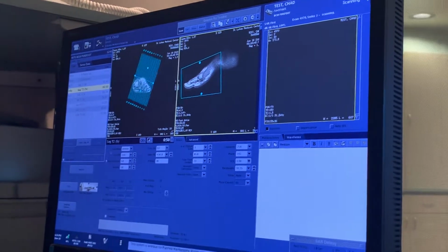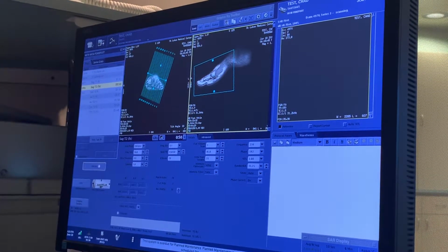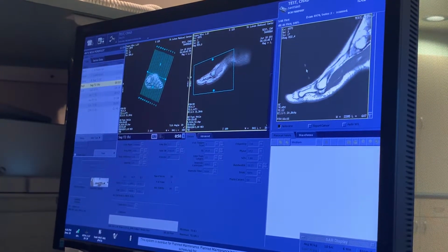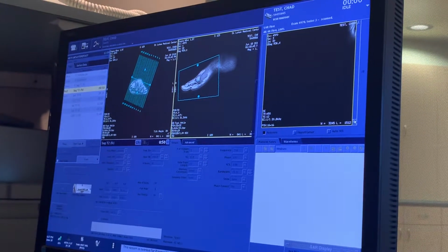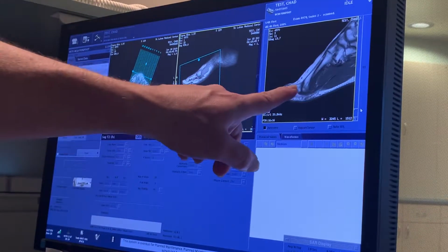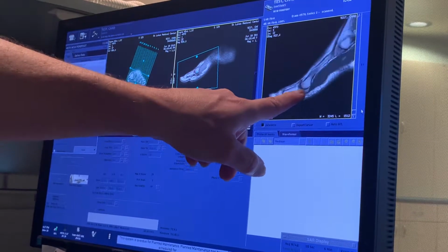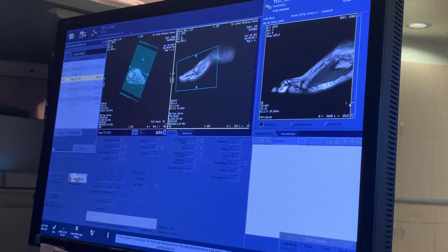Okay, so now this has a fat sat on it, so we're going to do a manual sat on this. So this is what this looks like. See, I've got all the way from skin to skin, and I've pretty much lined up. You see the heads of the metatarsals right here, how they line up nicely, and as you scroll through, you're scrolling through all the heads of the metatarsals. That's what the radiologist wants to see.